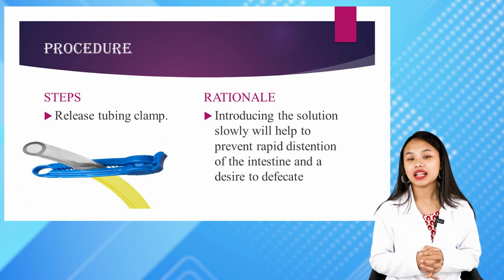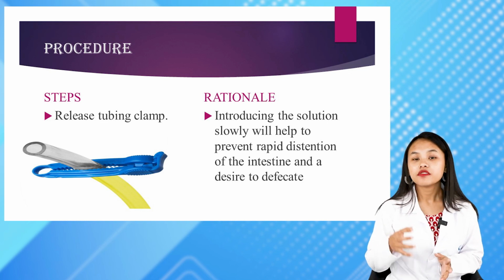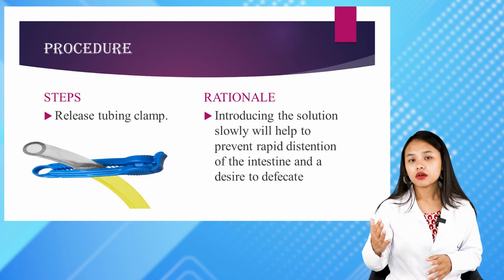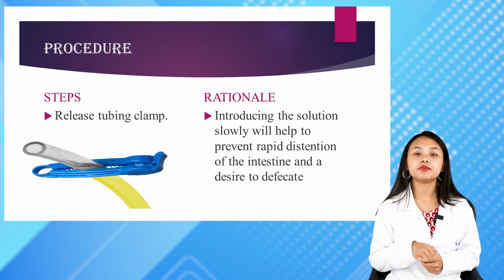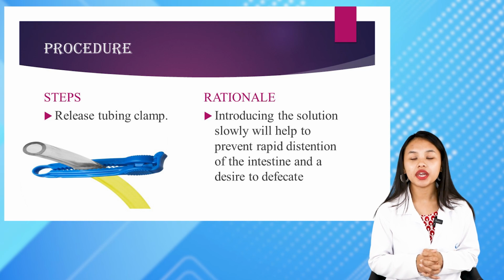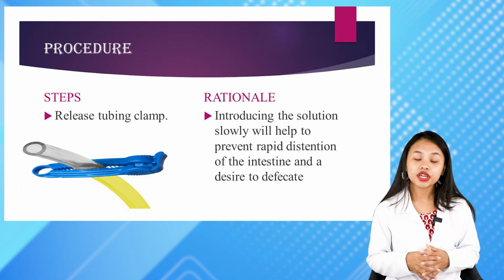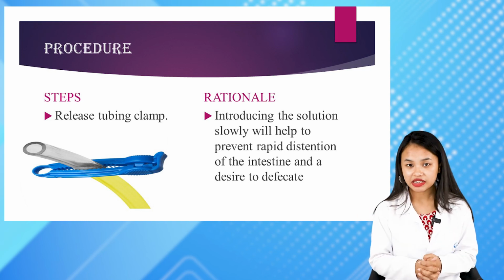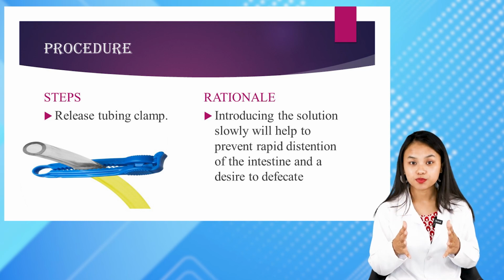Once this tubing clamp is released, only then will the solution flow. And here, while we are releasing the tubing clamp, we must make sure that the solution is being introduced slowly into the colon, the rectum or the large intestine, in order to prevent distension.